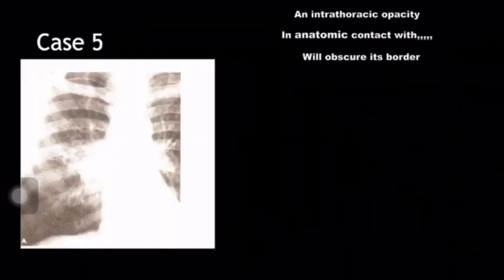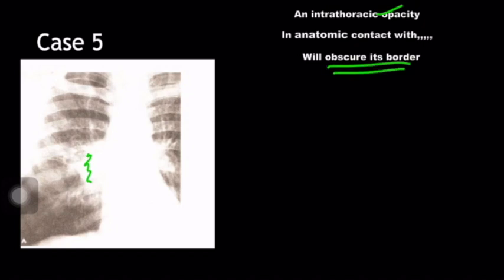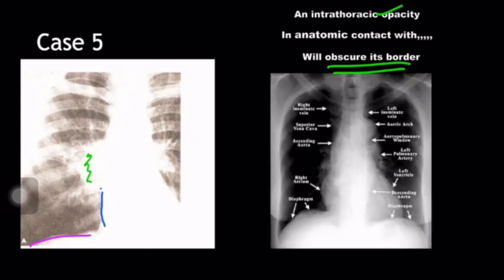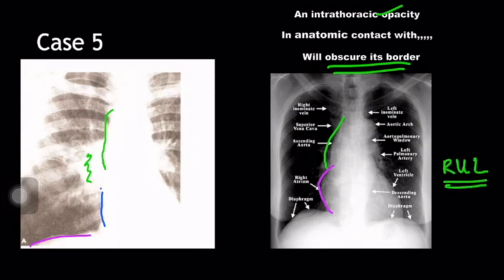Coming to case 5 — there is an intrathoracic opacity. The right diaphragm is intact. The right lower heart border is intact. Going by the anatomy, the lower part of the right mediastinum border is formed by the right atrium and further up by the ascending aorta. You can see that the lesion is obscuring the ascending aorta. The ascending aorta being an anterior structure, any lesion within the anterior part can obscure it. So you can localize it to the right upper lobe, to be specific, the anterior segment.